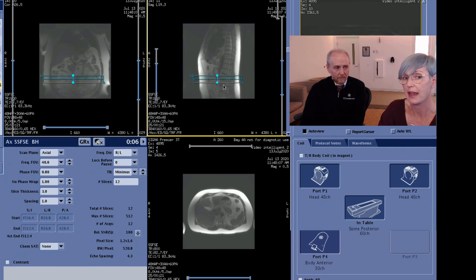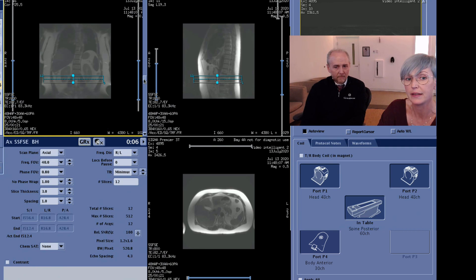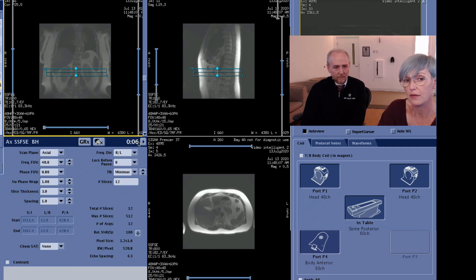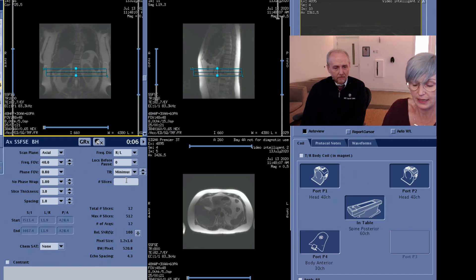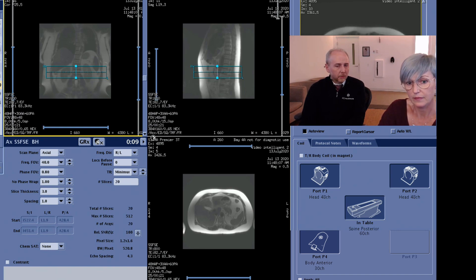Thinking about the acceleration we are using and everything else — in this case I just want to cover the kidneys here. Maybe I'll use some more slices. Yeah, that's really nice about AirTouch.